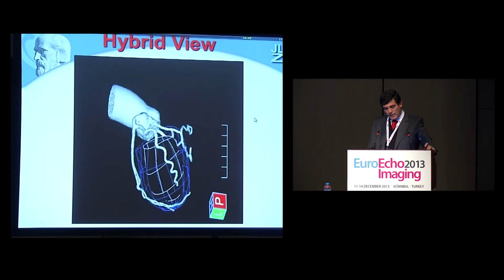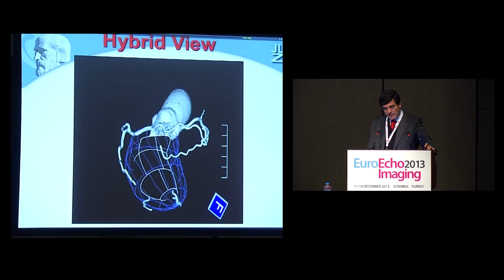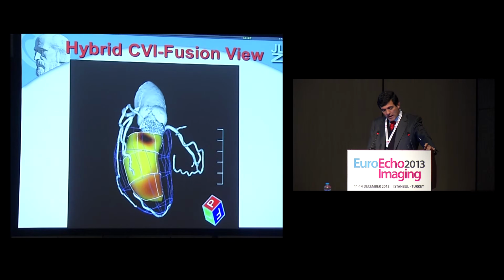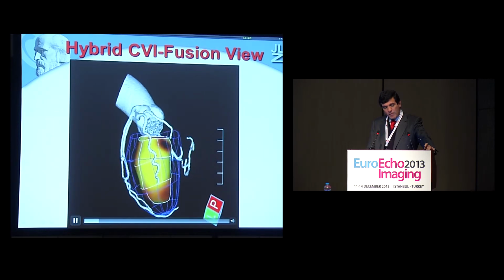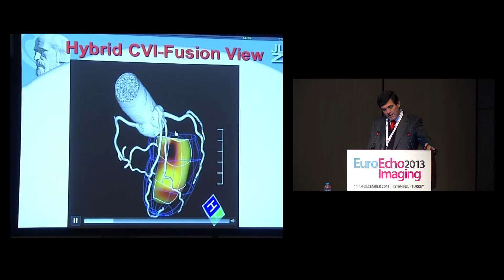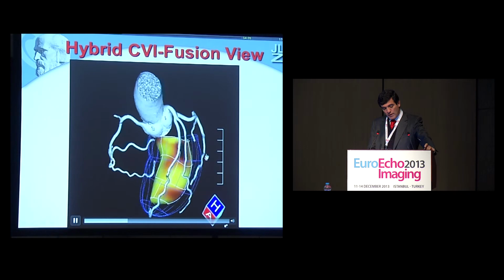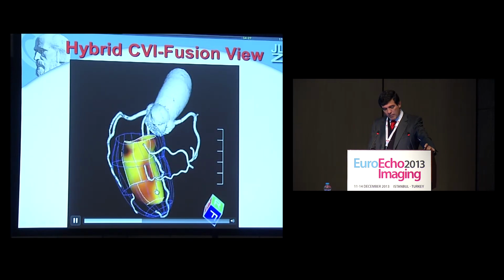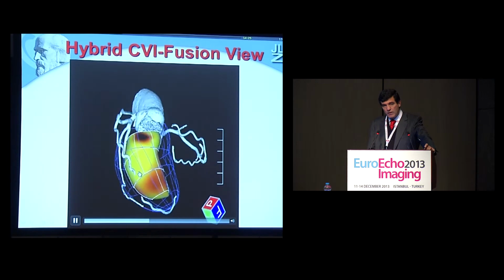And it is quite easy to obtain all this analysis. But moreover, now what we need to combine is the anatomical information with the functional information. So we can display, really, and we work with that, showing not only the position, but also if you see a stenosis, and also what is the information coming from the functionality of the heart.